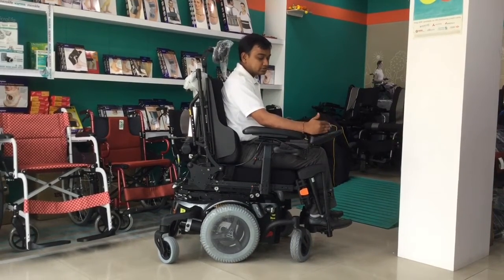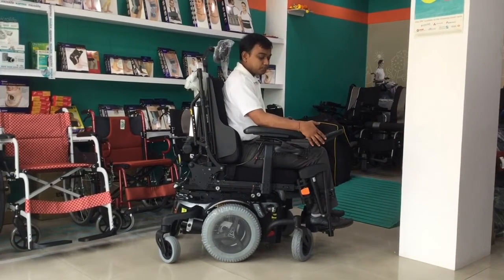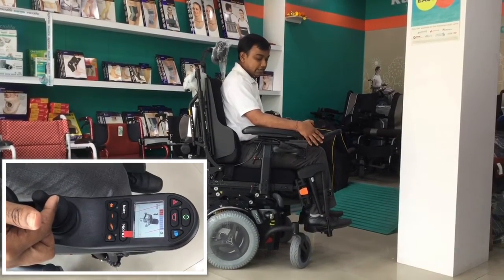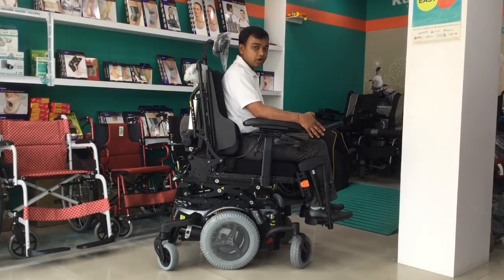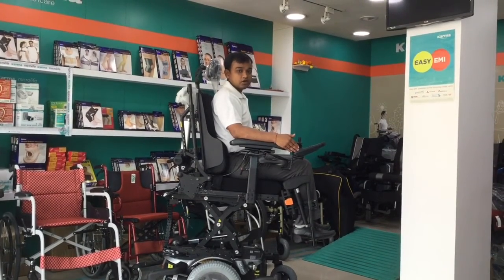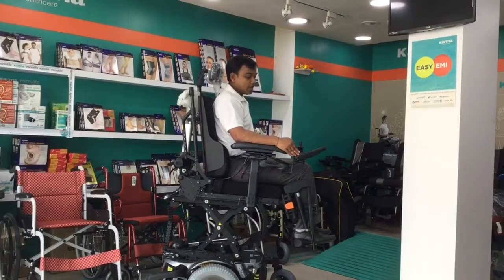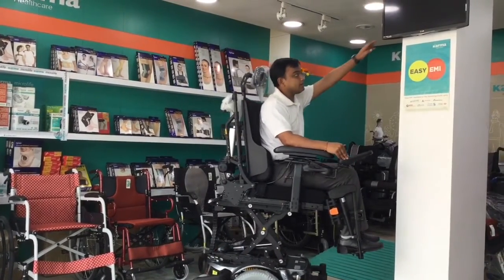You just need to adjust the lift function shown on the joystick and press this knob backward. You see, it is very steady and slowly the chair is moving upward. Now you can see my height has just increased. I have raised my seat height from 22.5 inches to 32.5 inches, and this can help me to reach height very easily.